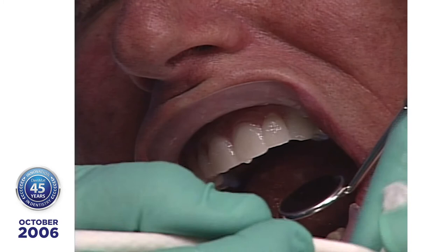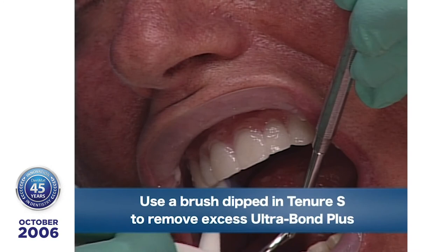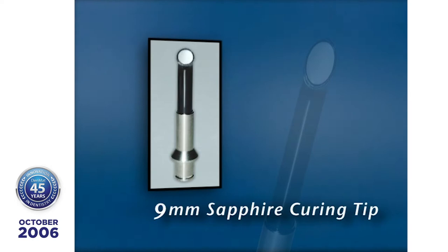And the Tenure S is beginning to set some of the Ultrabond, even though on the lingual side, we don't have any light on there yet. So you've got a lot of backup and fail-safe things here to make sure you get complete set of the Ultrabond. Now I'm going to polymerize one tooth at a time, 9 millimeter tip, 5 seconds. Close your eyes.